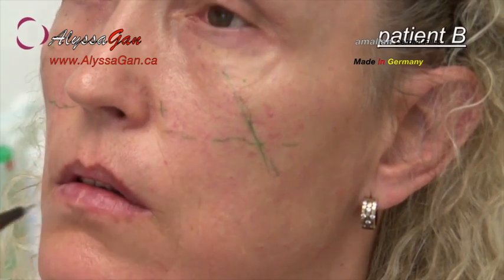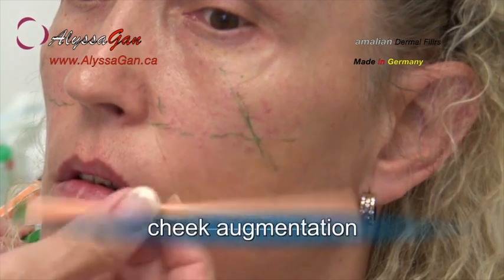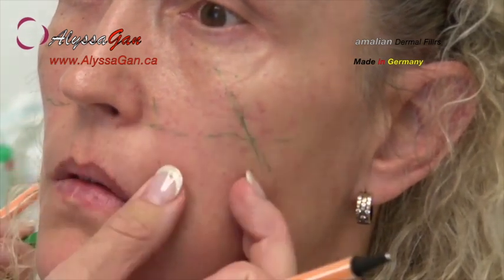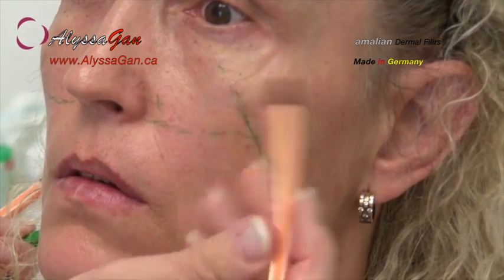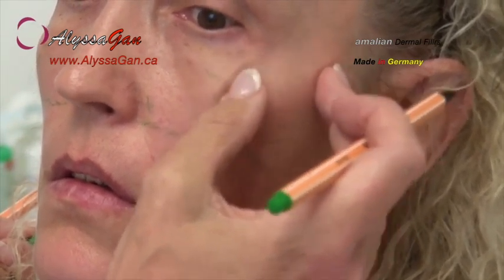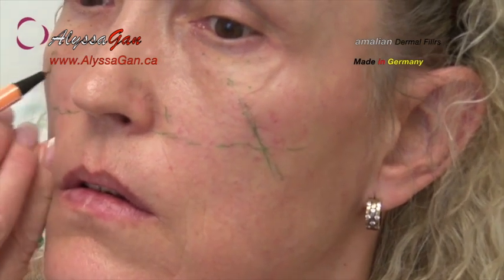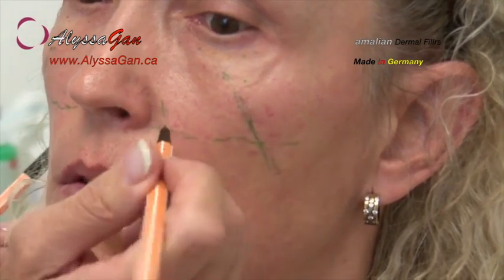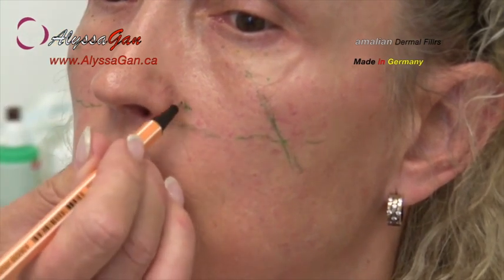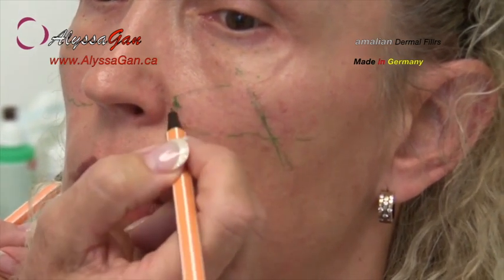The physician now treats another patient and first plans the procedure through marking. The horizontal line starting at the nose and going outward describes the lowest border for the injection of the implant. The other line marks the end of the osseous structure at the zygomaticus. It is important to know where the bone ends. Finally, the injection point is marked, including direction markings for the injection.